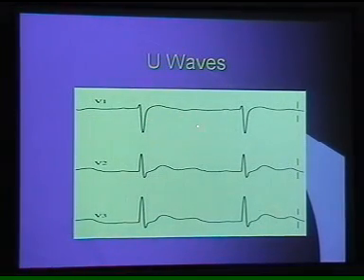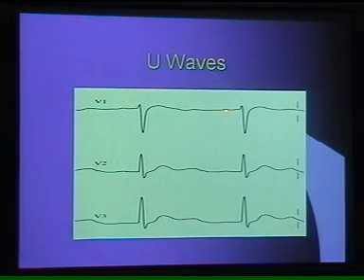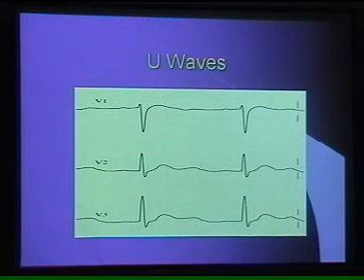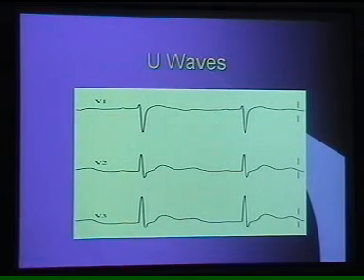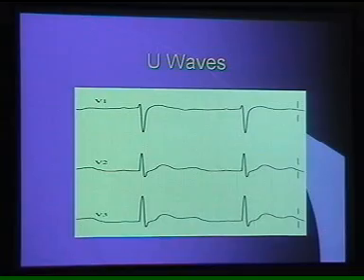Now, that is the typical picture. The T waves are flattened and an extra wave appears before the next P wave. This is called the U wave. So flat T waves and U waves and eventually prolonged QRS complex indicates the possibility of hypokalemia. And this is as reliable as getting the electrolytes done, and it's more easily available on the bedside. Next one.